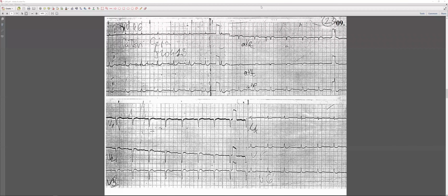I am giving you a difficult situation. A difficult one. All right. Okay, let's do this one. I'm going to share the screen, and give you the control. Okay, left click and you can go for it. All right.